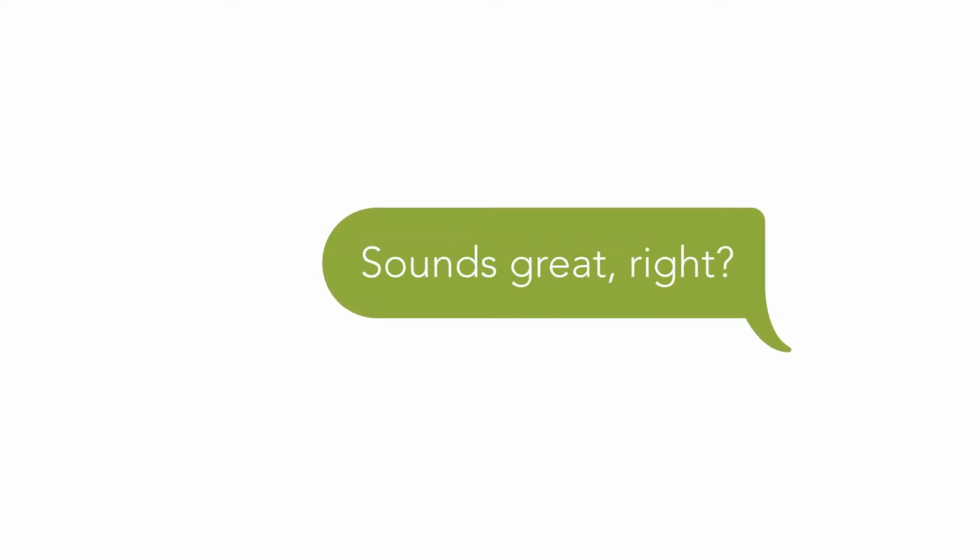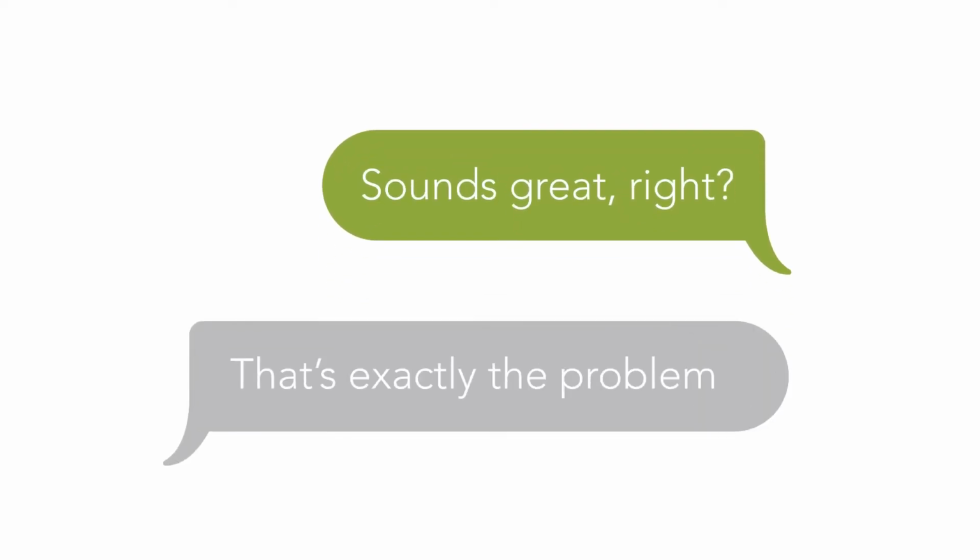Sounds great, right? Ironically, that's exactly the problem. Unfortunately, that perfect-looking result is actually hiding all the errors accumulated along the way. For example, that rotational error that we talked about before will get baked into the final registration, resulting in rotational uncertainty. Add to that the variability in MRI prostate capsule interpretation.